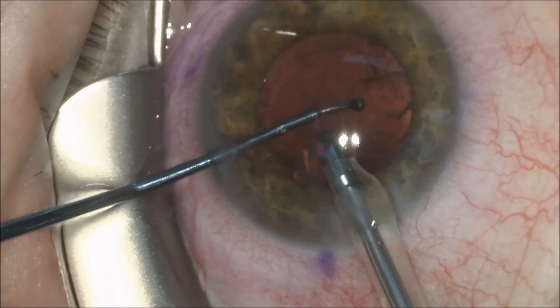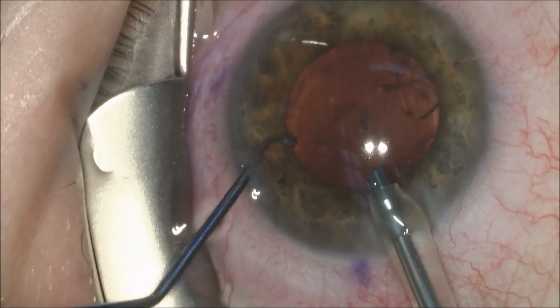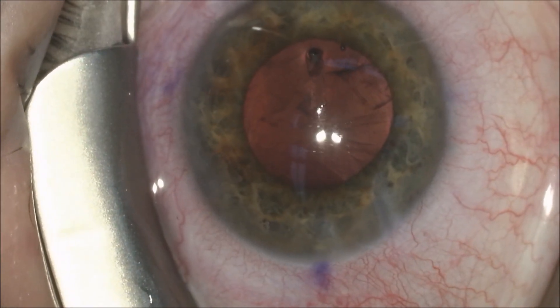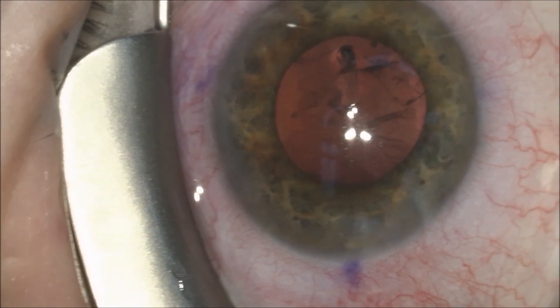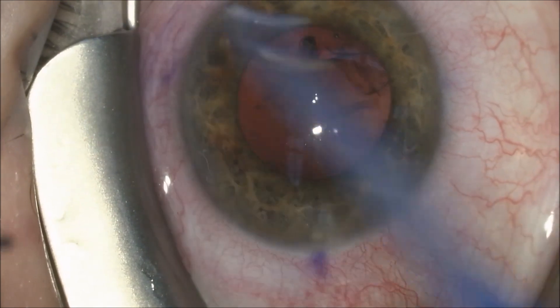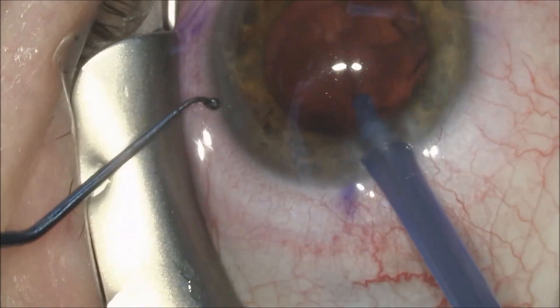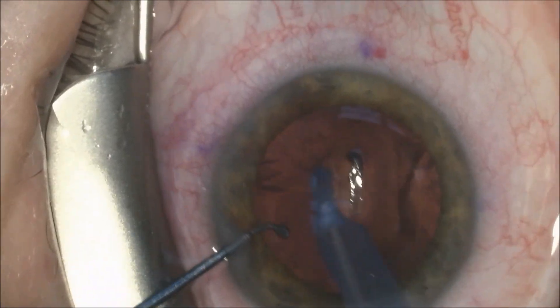Irrigation fluid enters the anterior chamber through the yellow or transparent sleeve of the handpiece to keep it formed. Once the cataract has been removed, there are some cortical remnants, which is the surrounding part of the cataract. We will remove this with the capsular guard handpiece, which is a silicone sleeve that is very capsule friendly.